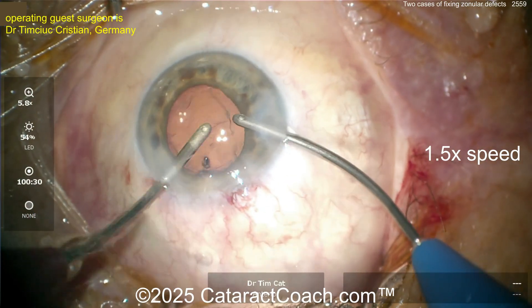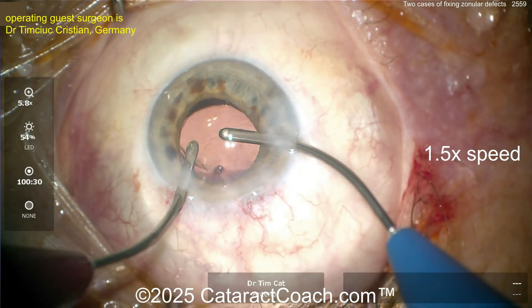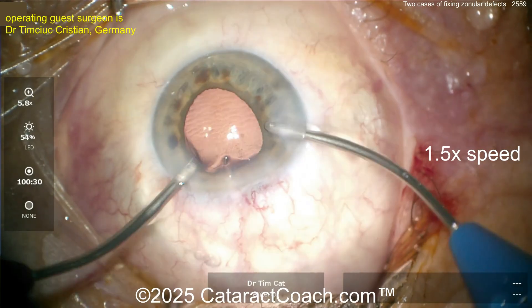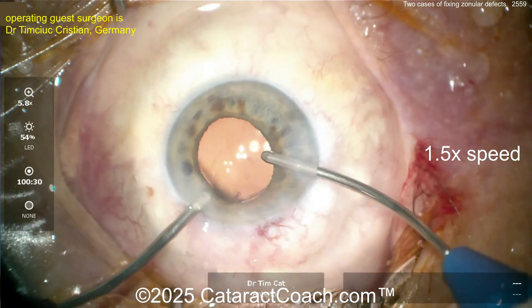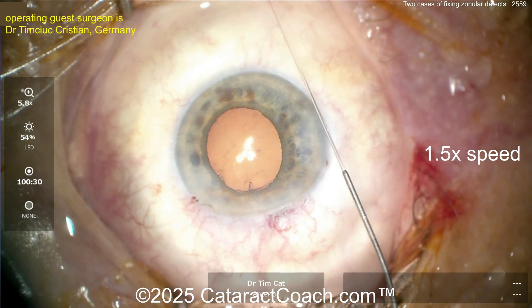Now going inside the eye — be very cautious. Take out the viscoelastic; I wouldn't touch the lens at all or do any further manipulation. If you need to, a little bit is okay, but be very cautious. Better to just call it good and be done with the case. Going in nice and easy, taking out the viscoelastic, and we're done with this case.